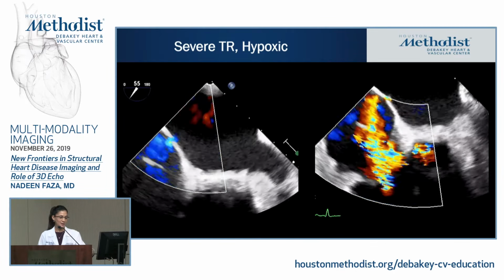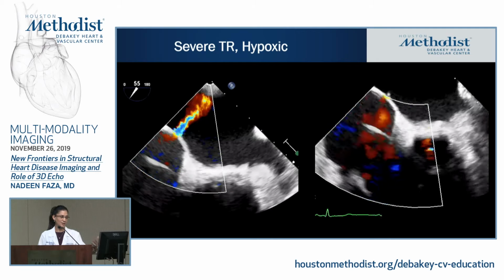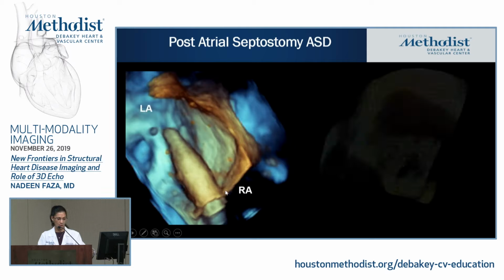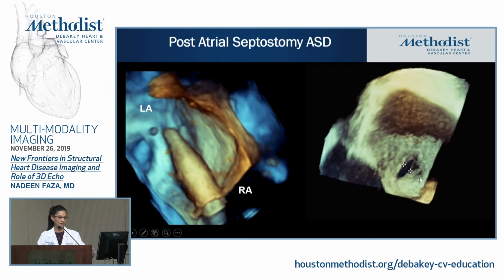And again, this is an iatrogenic ASD caused by this balloon that was placed during the mitral valve-in-valve procedure. So this is your balloon septostomy. And if you do 3D imaging of the septum, you notice that the defect is irregular shaped, and 3D can be very helpful in sizing it so you know what closure device to use.